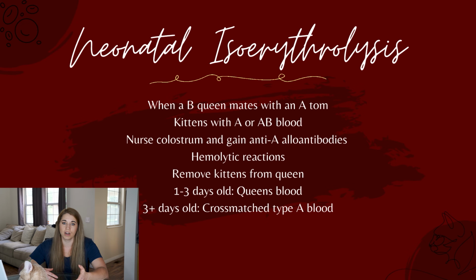After this 3-day mark, when they have started to develop their own alloantibodies, then they should receive type A, preferably cross-matched blood.